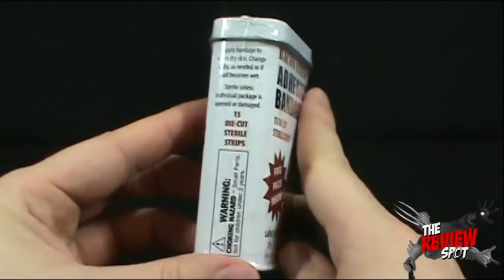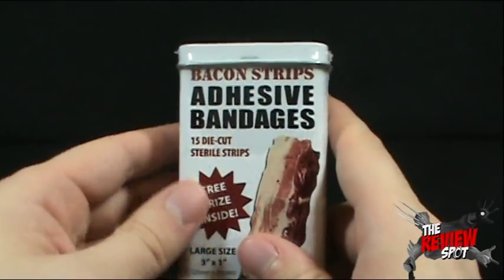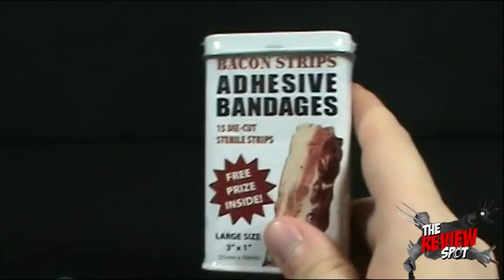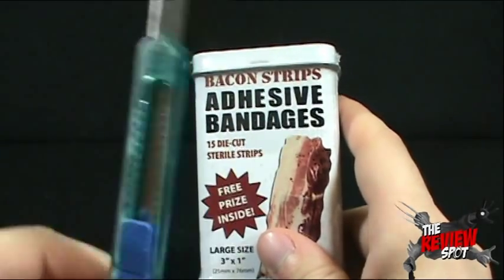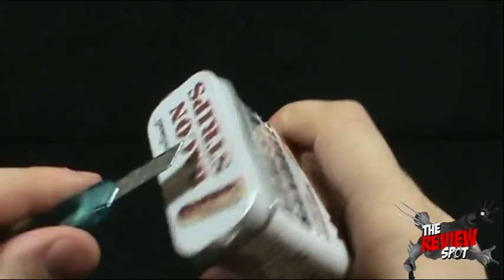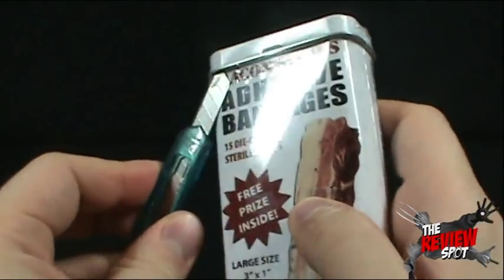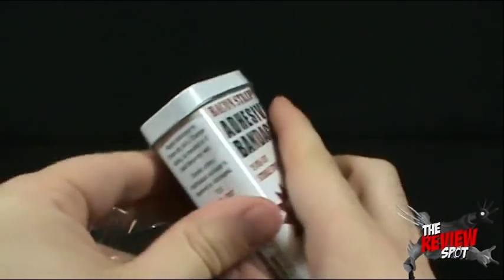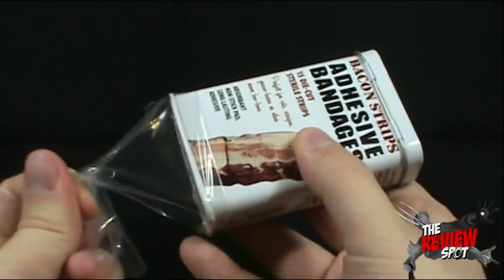Apparently it tells you how to apply a band-aid — very crucial. I'm going to get this opened up with Hank. The irony of using Hank to open up a container of band-aids — quite ironic, if you ask me. If I wasn't too careful with this guy, I certainly would be in luck because I would be reviewing these guys.